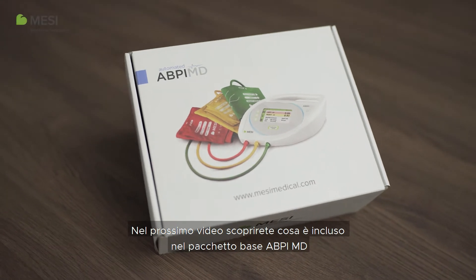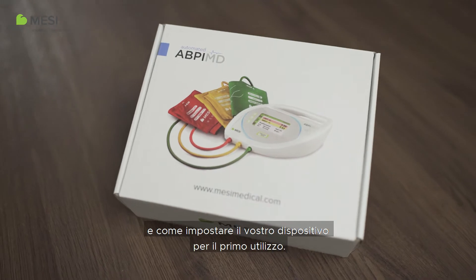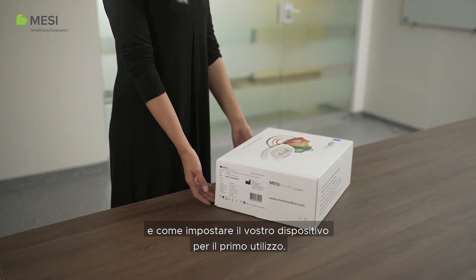In the following video, you will find out what is included in the basic ABPI-MD package and how to set up your device for first use.